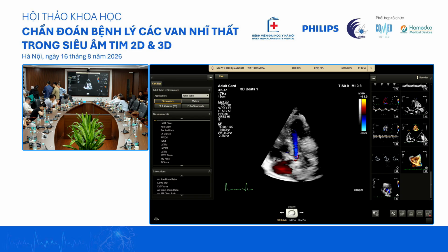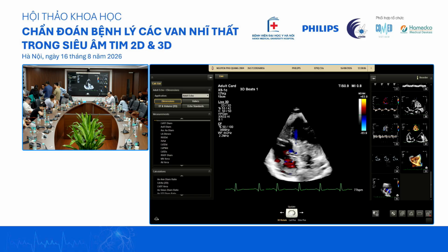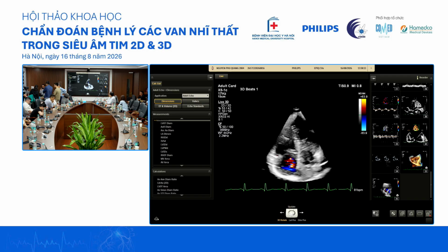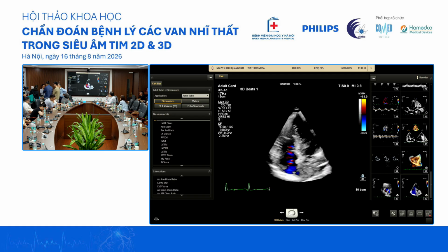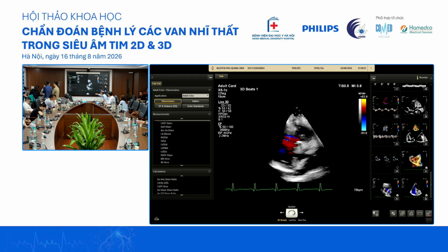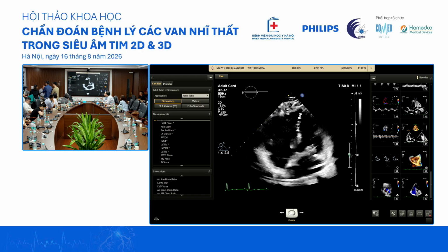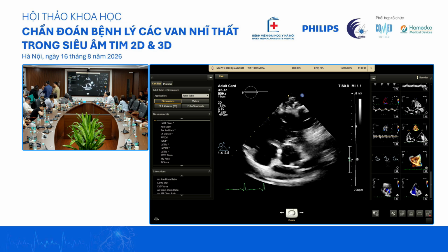Then we turn on live 3D. Here should be septal anterior. So it's a central jet. Central jet. Is it functional? The main reason is why it's functional.